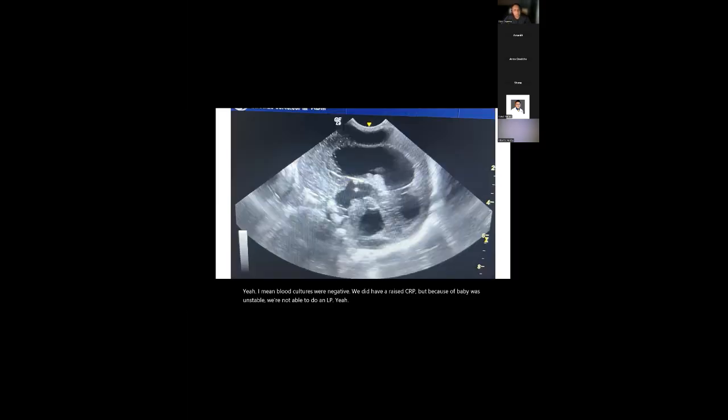Yeah. So here I tried to get a midline. So would you say this is the third ventricle? Correct. Dilated with some clot inside. Yep. Fourth ventricle here? Just about. I think you've got the cerebellar view coming in here, and the fourth ventricle would be here. A little bit difficult to say whether that might be an element of the temporal horn. But I think you're right.